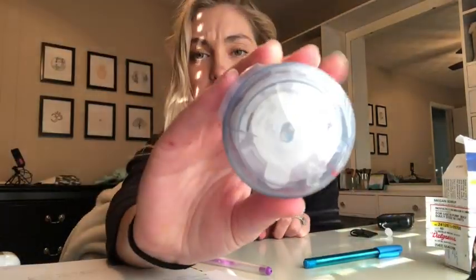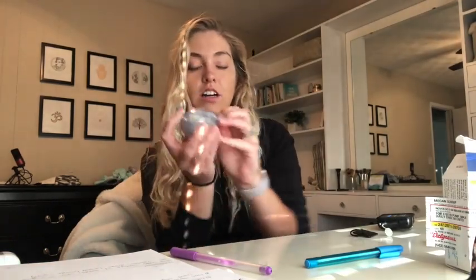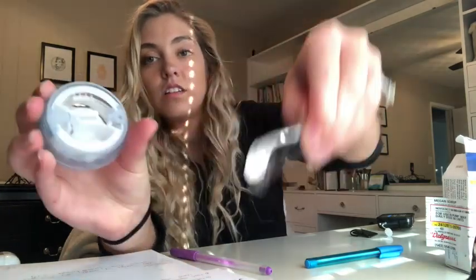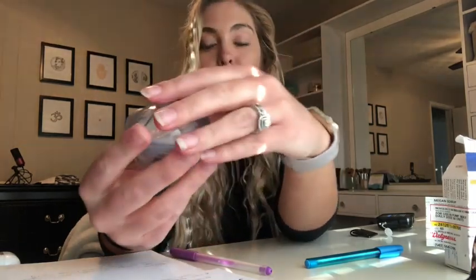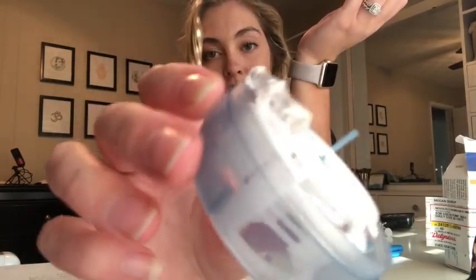Now it says, make sure the set is disconnected from your body and securely connect the tubing to your cartridge. So that's the tubing of the insertion site. So for Tslim, this is what your insertion site looks like in packaging. So I'm just gonna go ahead and take off the plastic wrap, take off this little white protective thing, and then pop off the lid, but I keep the lid because after I insert the site and the needle is still in here, I recap it and put it in my sharps container. So just pop it off like that. So that is the packaging and the little needle.